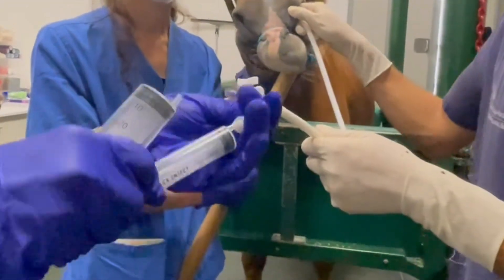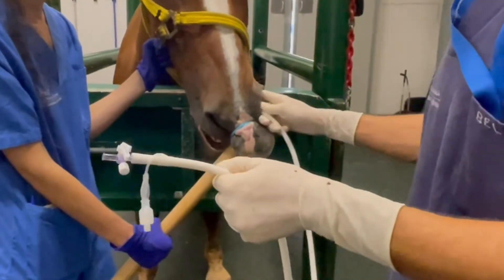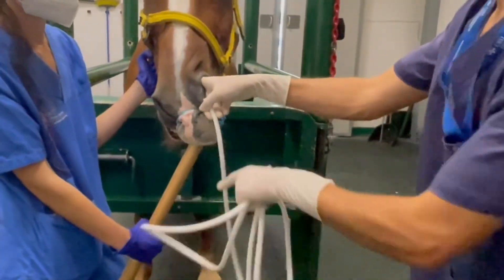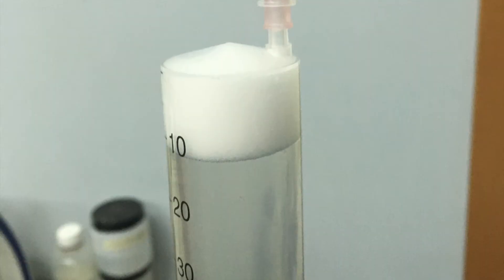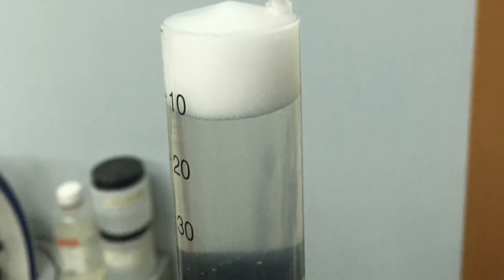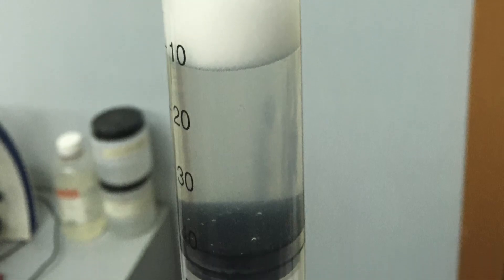The yield of lavage fluid may range from 30 to 70 percent of the volume infused. Following sample collection, the catheter balloon tip is deflated and the catheter withdrawn. Here you can see an example of the sample retrieved. The sample obtained should be pooled and submitted immediately for cytologic analysis.